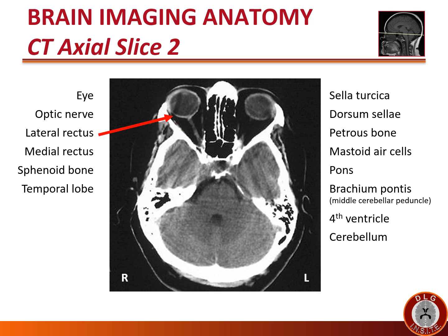The lateral rectus is the muscle lateral to the eye that abducts the eye. The sphenoid bone is seen once again, forming the posterolateral aspect of the orbit. At this level, we more clearly see the temporal lobe in the middle cranial fossa. Note the streaky bony artifact obscuring the parenchyma in the temporal lobe.